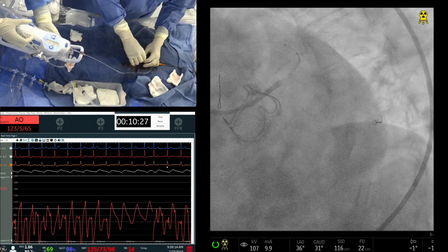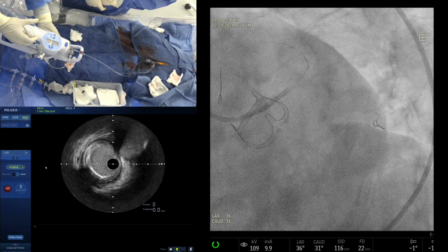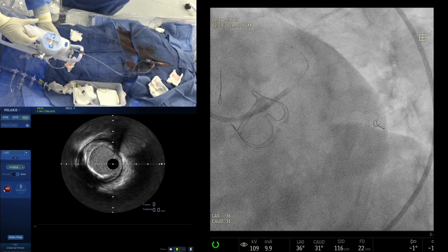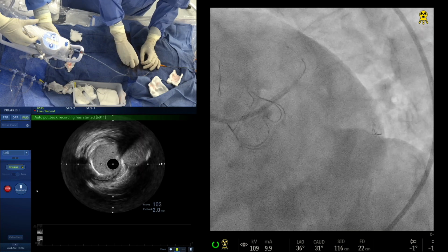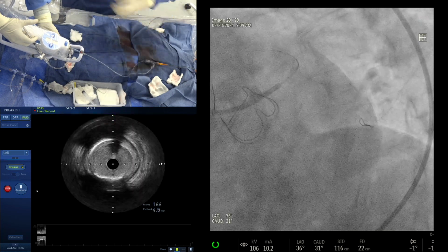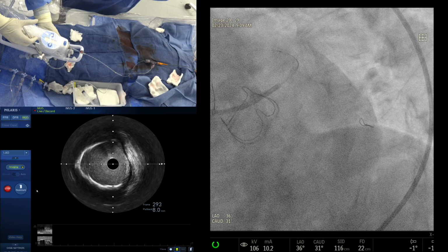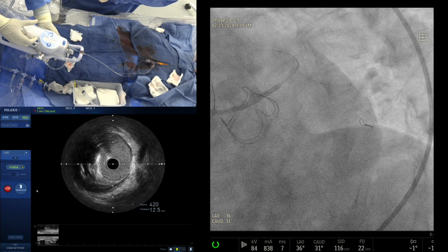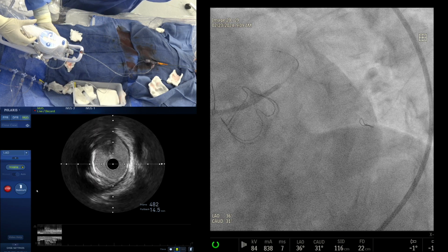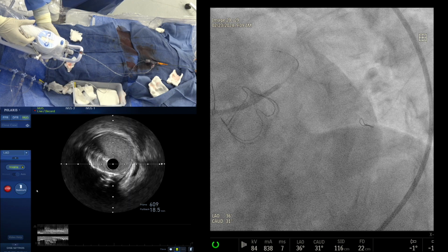Sure, which we have not done before. Okay, show it. Yep. So it's on the lesion, just at the level of the bifurcation. Am I at the diag, the large diag? Yeah, this is the diag. Yeah, that's good. Okay, pull back. I think this is a good landing zone, with good lumen. Yeah, this is the nodule again, the proximal LAD. Still LAD. I think it's an ablated nodule.